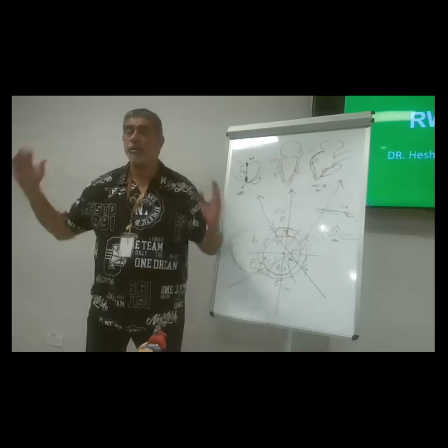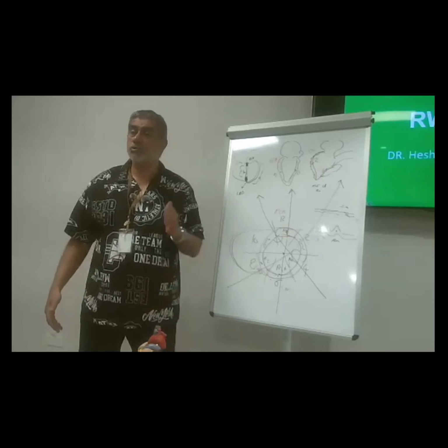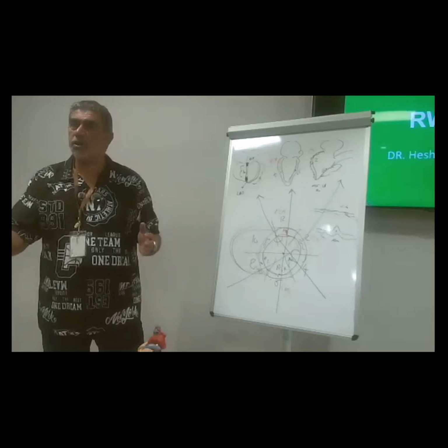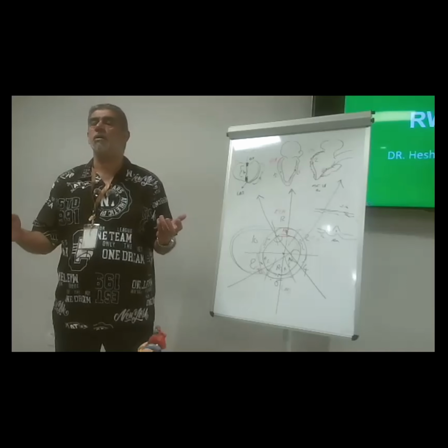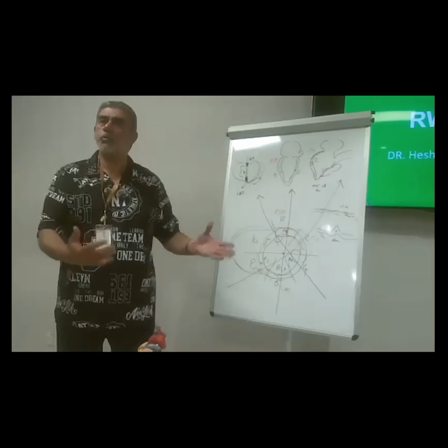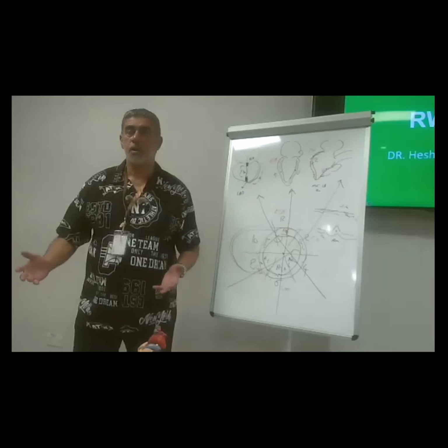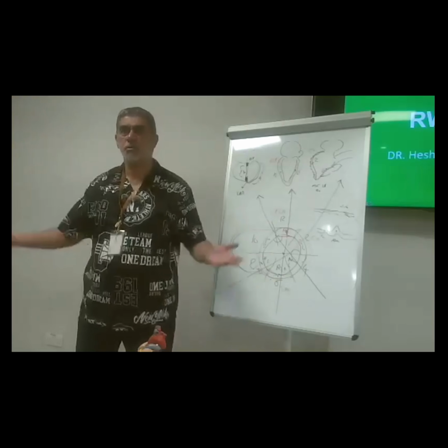All this direction happens by regionality. Regionality is very important, especially in the post-bypass time. For you as a cardiac anesthesiologist, it is most important in the post-bypass time, and post-bypass time is the most critical time in cardiac surgery.